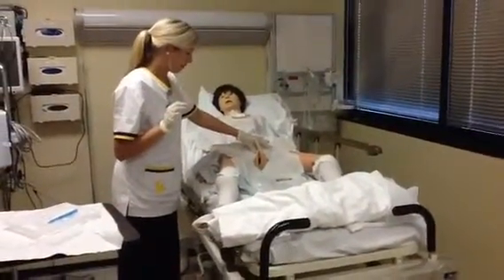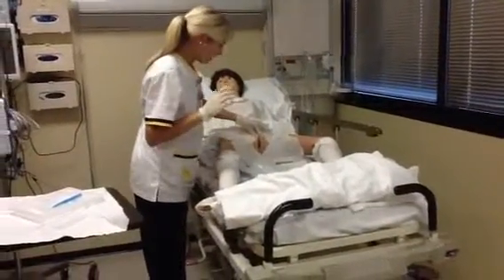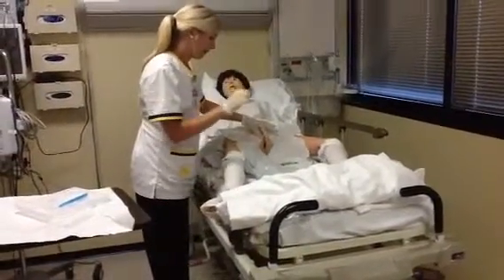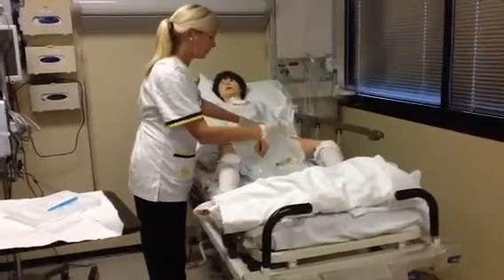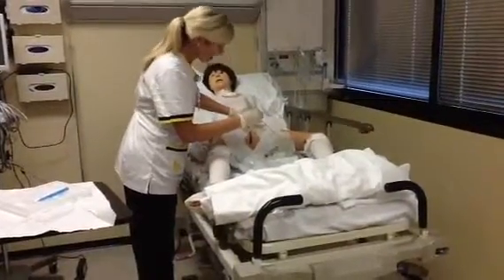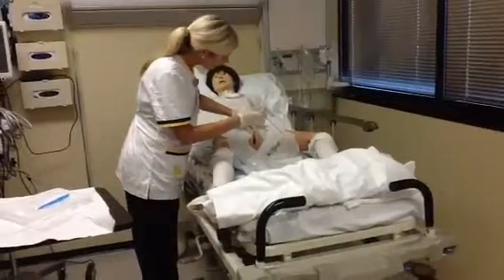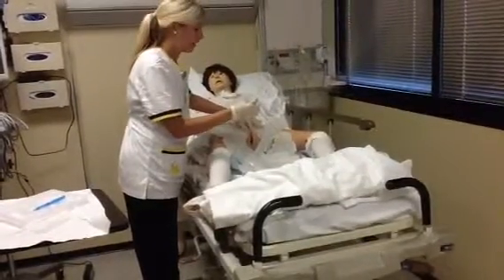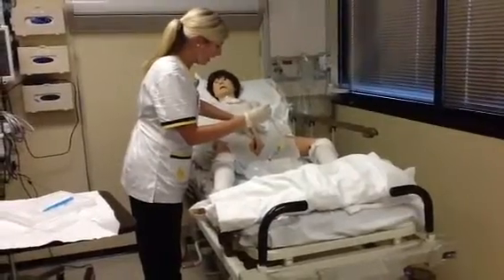So the next thing I'm going to do is visualize the meatus, and I'm going to go ahead and grab my catheter. I'm going to hold it 2 to 4 inches back. And I'm making sure not to ever touch it, let it touch anything, or touch the labia, to make sure it doesn't get contaminated.